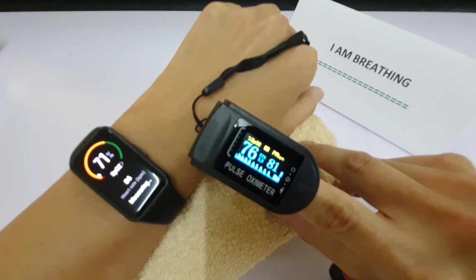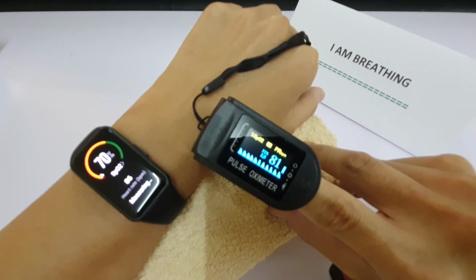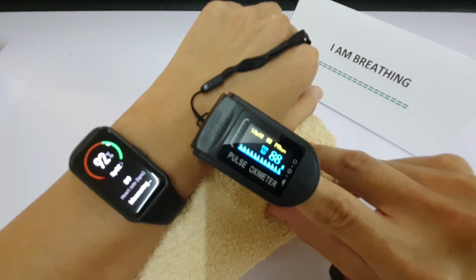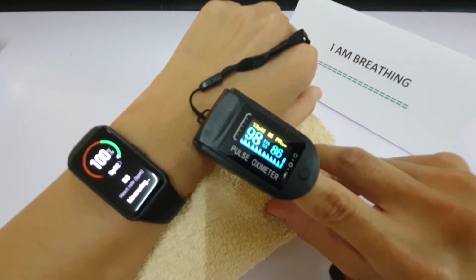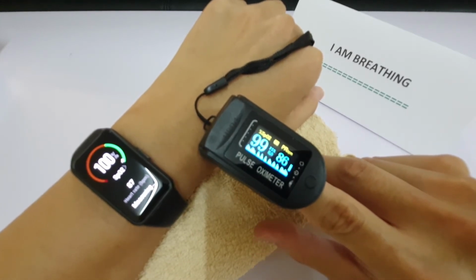Okay, so let's see the recovery curve and see how that's doing. Okay, I'm breathing again. So let's see the oxygen recovery. Okay, so this particular round, it seems that the band seems to be okay. This is the second measurement. The first measurement wasn't so good.